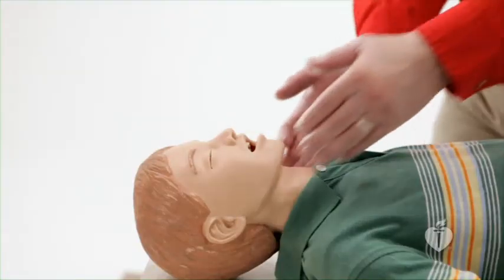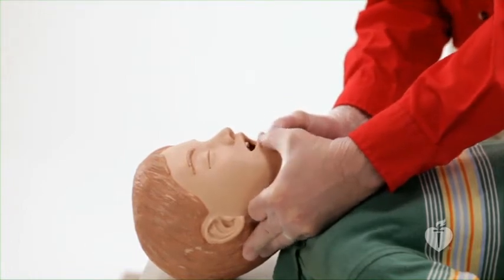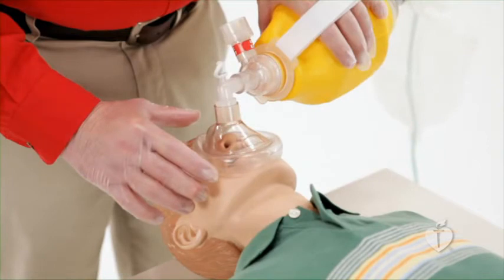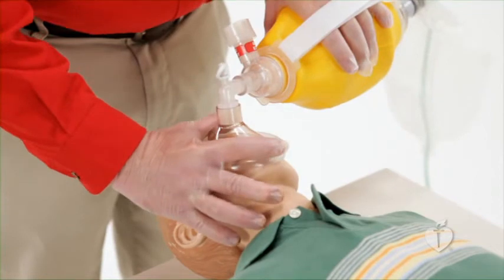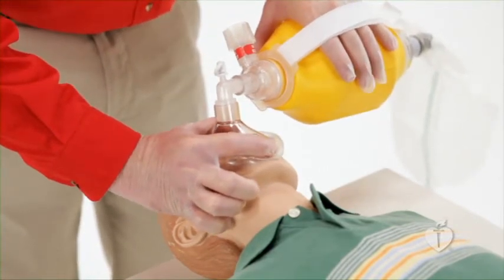If neck or spinal trauma is suspected, attention to simultaneous cervical spine motion restriction is important. To use a bag mask device, position yourself directly above the child's head. Place the mask on the child's face using the bridge of the nose as a guide. Use the thumb and index finger of one hand to make a C to press around the edges of the mask. The remaining fingers of your hand should form an E to lift the jaw and open the airway.